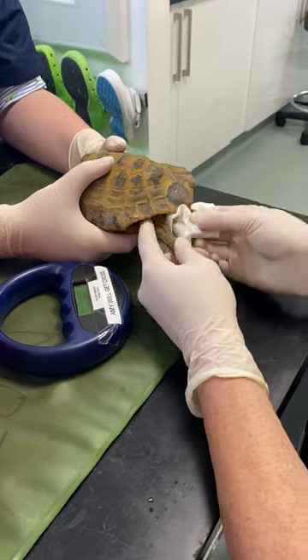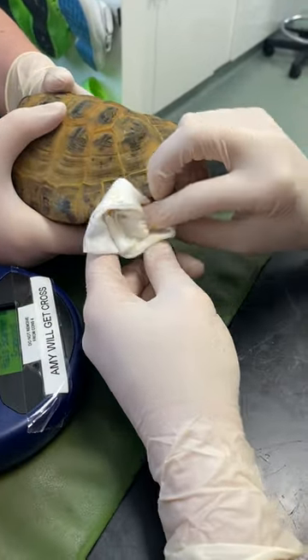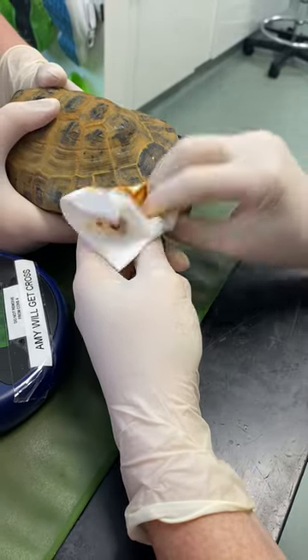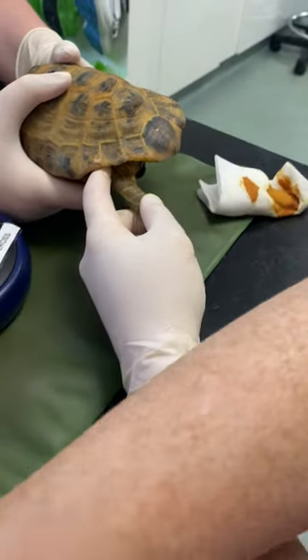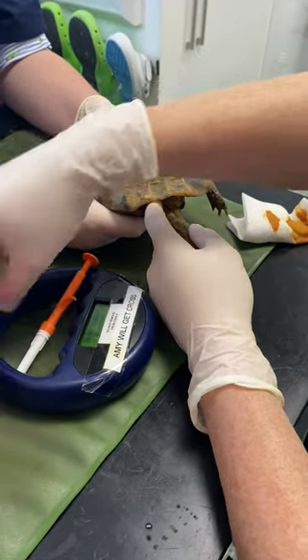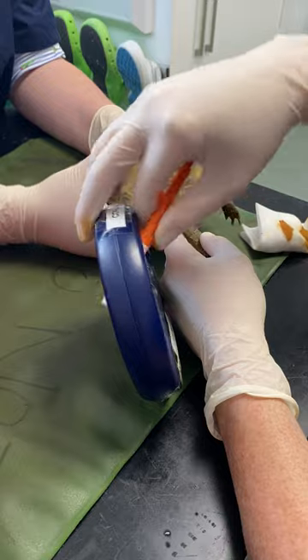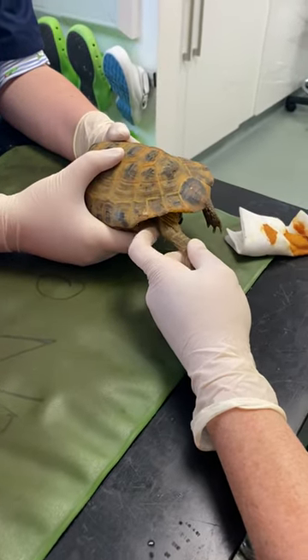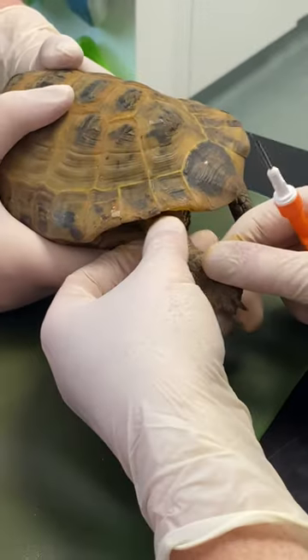We always want to make sure the leg is nice and clean first. We're going to be placing the microchip just underneath the skin, so giving it a good clean. I've got my microchip ready, and we want to make sure it scans and we've got the correct number.